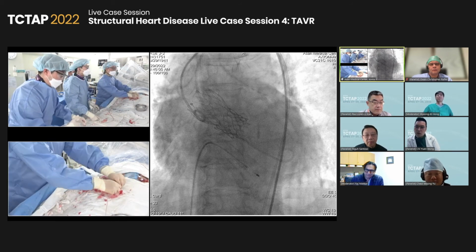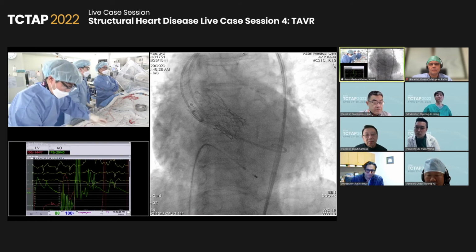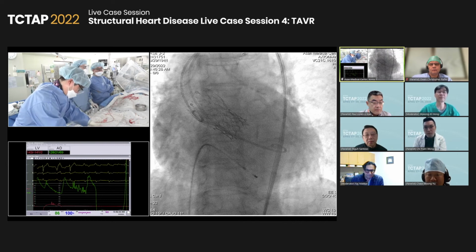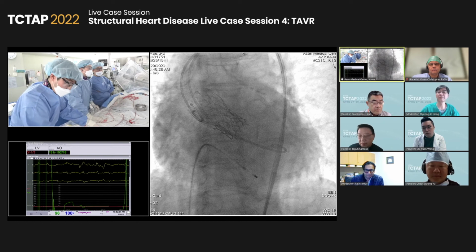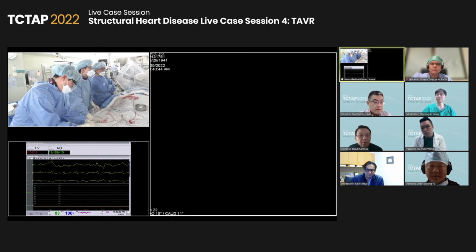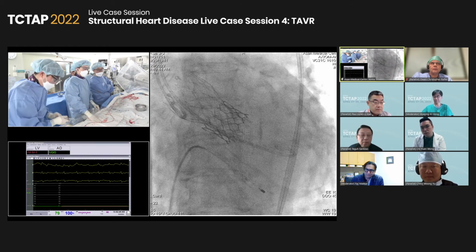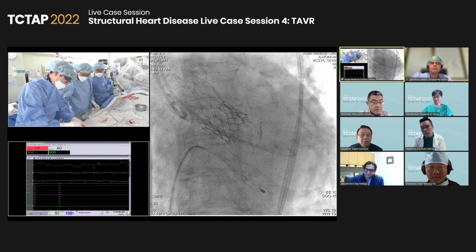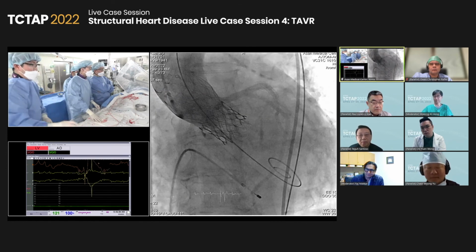Okay, you're gonna show us. We will show the monitoring. Okay.